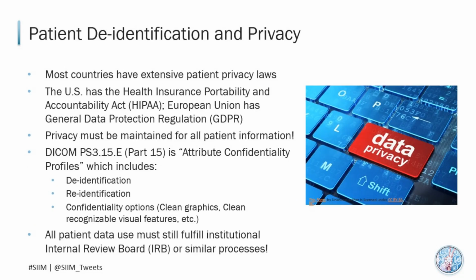Indeed, whenever we deal with patient information, there are many regulations like HIPAA and GDPR that the system needs to comply with and handle PHI properly. In DICOM Part 15, it defines various attribute confidentiality profiles that handle different levels of confidentiality. Different systems have different levels of support for these profiles. Also, as an AI model provider, you will need to check with your PACS partner and the customer to see what responsibility each vendor has to take on.